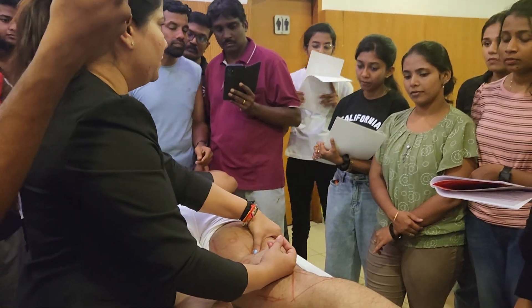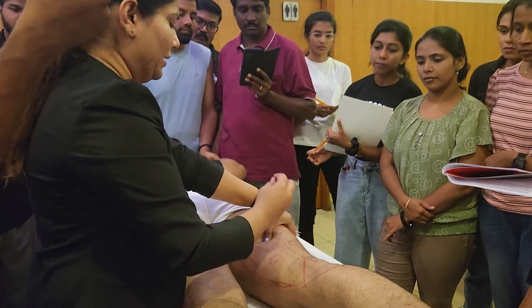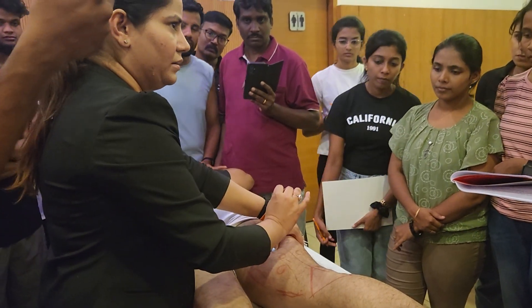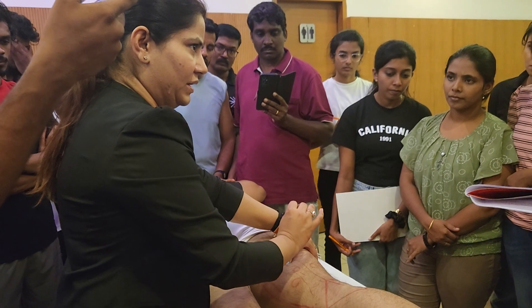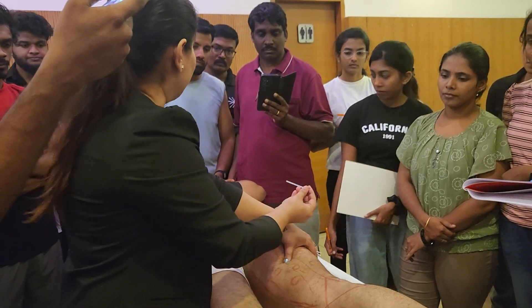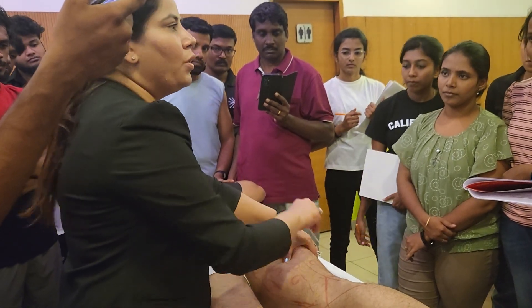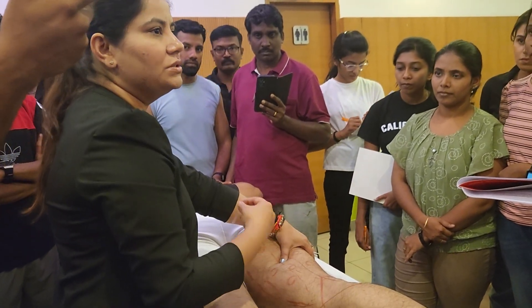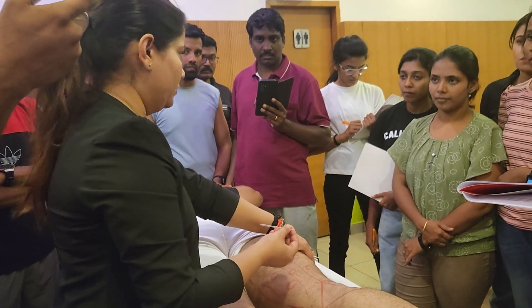You will pick it up and either you go away from the midline, cephalic or caudal. These are the three directions what you can do.